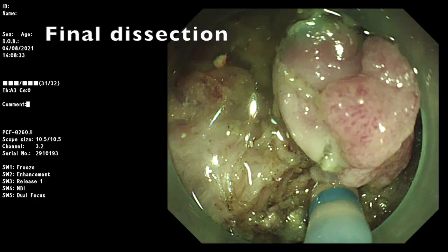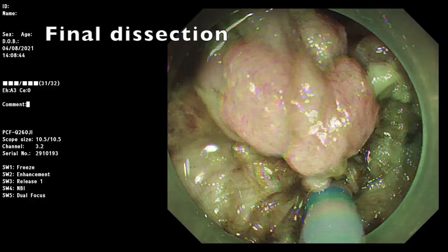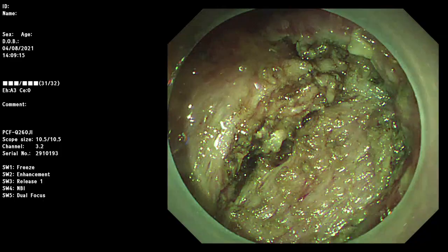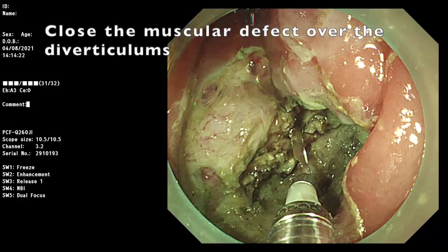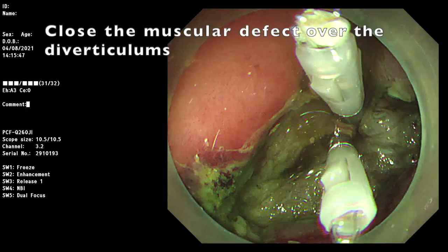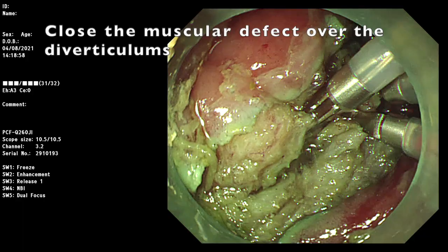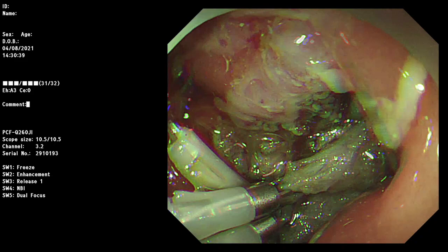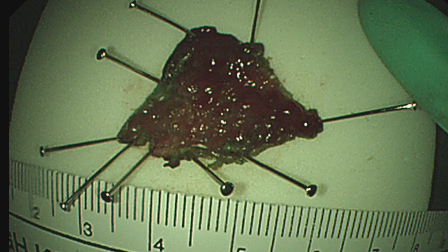Finally, the specimen was en-block resected without complication. We use foreclips to close the muscular defect to prevent delayed perforation. The total procedure time was 180 minutes, and the pathology revealed tubular adenoma with low-grade dysplasia.